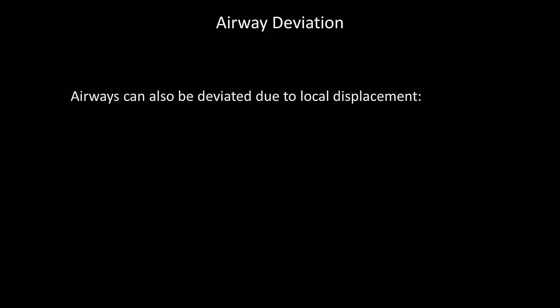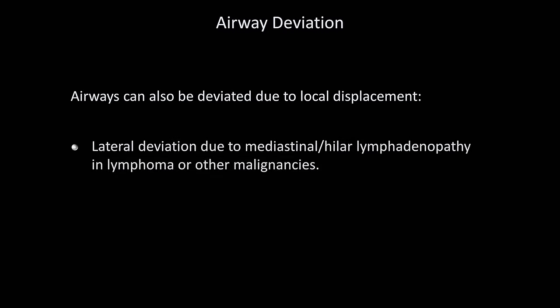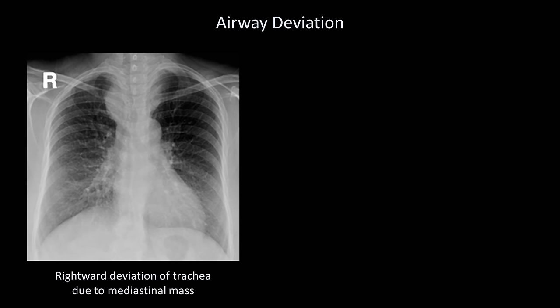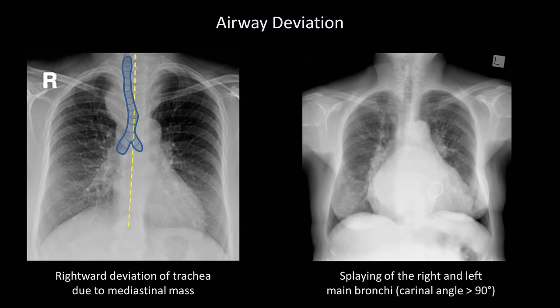Airways can also be deviated due to local displacement. There can be lateral deviation from mediastinal or hilar lymphadenopathy in lymphoma or a mass from other malignancies, and there can be splaying of the right and left bronchi by extreme left atrial enlargement. Here is an example of rightward deviation of the trachea due to a large mediastinal mass, which turned out to be an enormous goiter. And here is an example of splaying of the right and left main bronchi from left atrial enlargement, with a carinal angle well above the normal cutoff of 90 degrees.